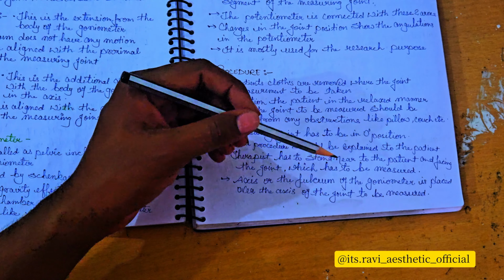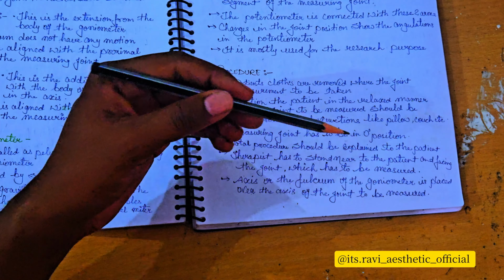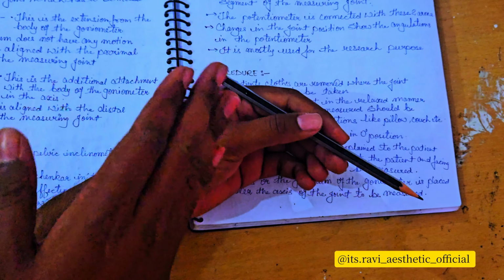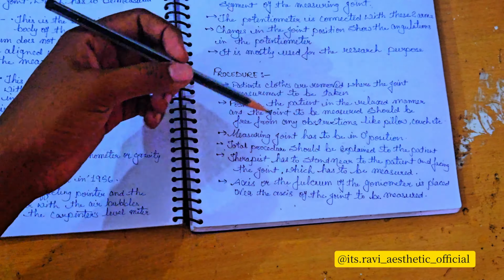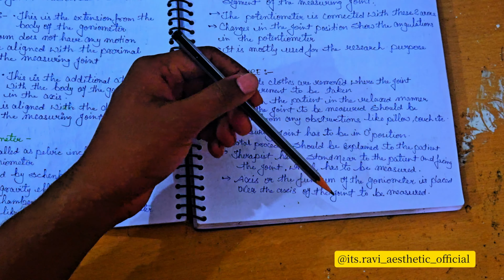The therapist has to stand near the patient, facing the joint which has to be measured. Like that, if you are measuring the elbow joint, you stand nearby the joint. You can't stand on the opposite side and measure the joint. It can give a wrong measurement if you do that. The axis, or fulcrum, of the goniometer is placed over the axis of the joint to be measured.